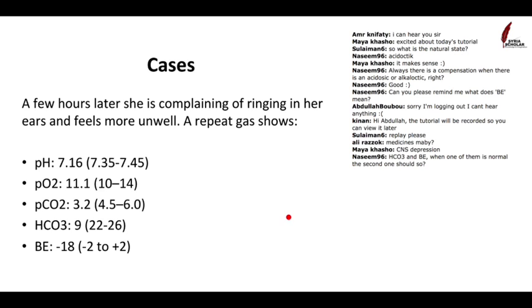So with the base excess and the HCO3 question, they are effectively the same thing. The ranges that the labs use might vary between different labs, but if one is in range, the other one is roughly in range. If you're on the borderline, just because of the way the labs run them, they might look a bit different. But a lot of people ignore the base excess, and just choose the one that's easier. The bicarbonate makes more sense intuitively because you don't have to run a second calculation to work it out. It's the more simple way, and it tells you exactly the same thing.